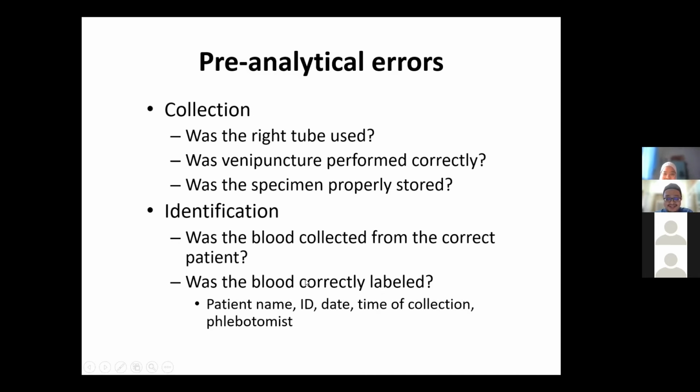Was the blood correctly labeled? Yeah. So apa yang kena ada pada any blood specimen? Kena ada patient name, and then ID, date, time of collection, and the phlebotomist initial. So like Nur Shakira. Nur Shakira, what is your father's name? Muhammad Ansor. Okay, so your initial would be something like NSMA. Okay, that one is your initial. Mine would be MAMS.